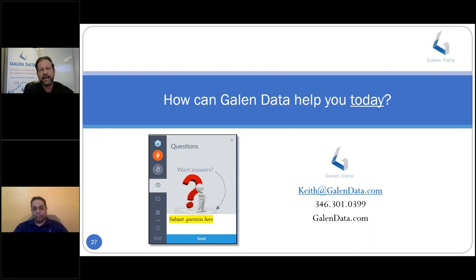Not just, well, I've got security on my device, I'll worry about my cloud connectivity security later. Does that make sense? Yes, and best practice in cybersecurity is to look at a holistic system level view. So you look at the whole system and you find vulnerabilities, not just one component. So a system here is the entire medical device system, right? Not just a device, but your base stations, your users, also the cloud or anything like that.